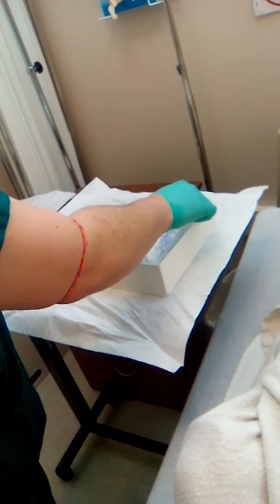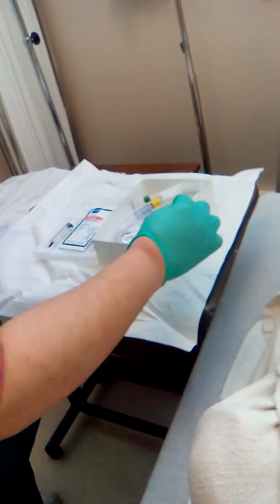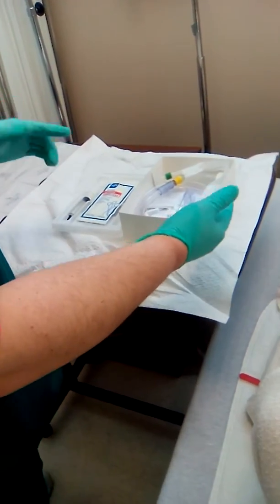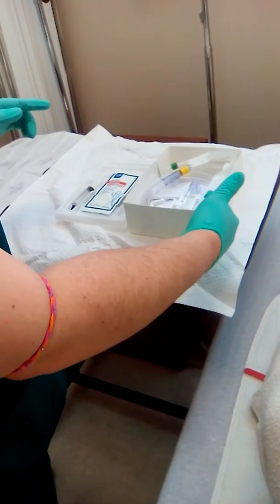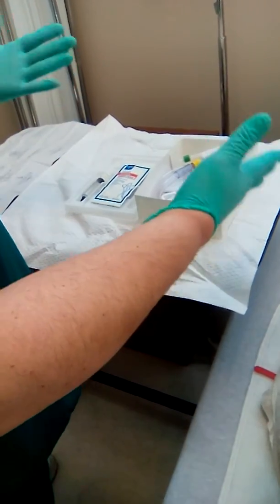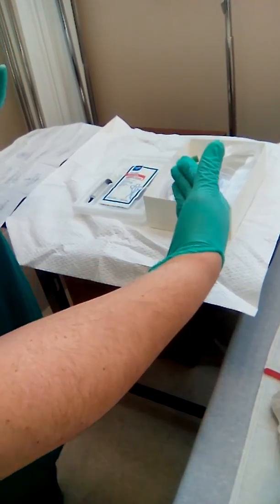I believe I just broke sterile by letting my arm cross right here within the ungloved part. I would discard my box and get a new set.